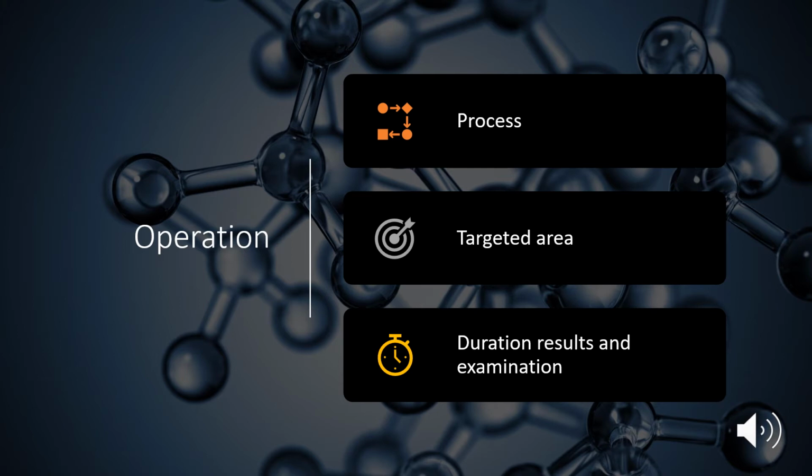Once the body is moving forward inside the tunnel, which is a big circle, it is scanned with the special digital detector. After being scanned and the data transmitted to the computer, the image will be displayed.